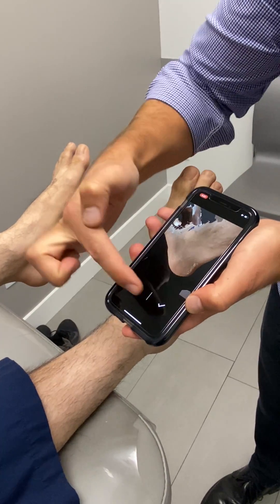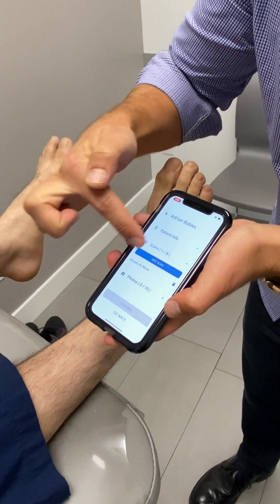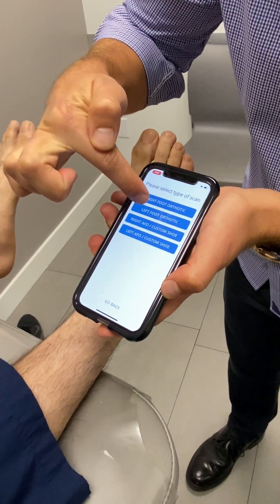I'm going to accept that and add another scan — I'm going to do the left foot and the right foot.